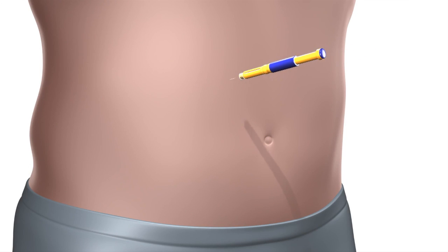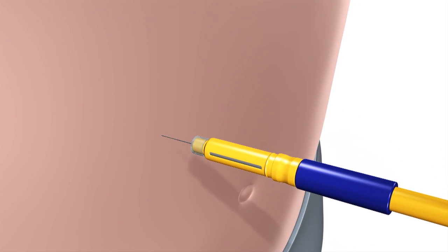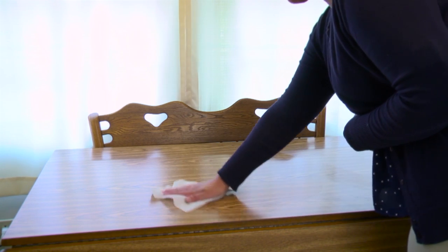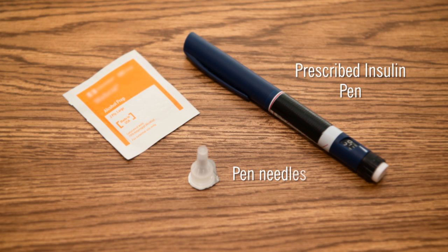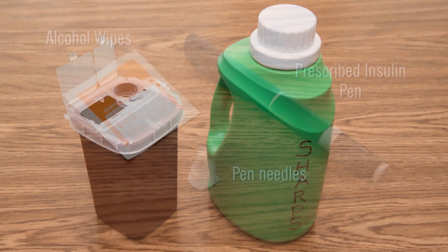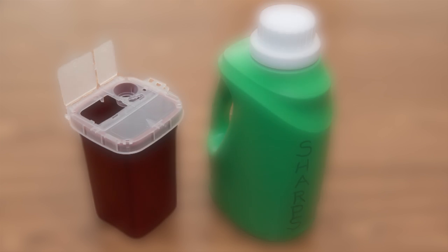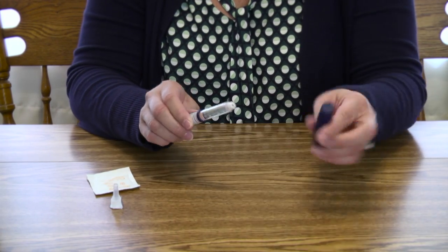An insulin injection delivers medicine into the subcutaneous tissue, which is the tissue between your skin and muscle. Subcutaneous tissue, also called sub-Q tissue, is found all over your body. Your health care provider has chosen insulin injections done with an insulin pen as the best option for you. The supplies you will need include the prescribed insulin pen, pen needles, alcohol wipes, and a container for used equipment. You can use a hard plastic container with a screw-on or tight lid, or a commercial sharps container. Begin by washing your hands.